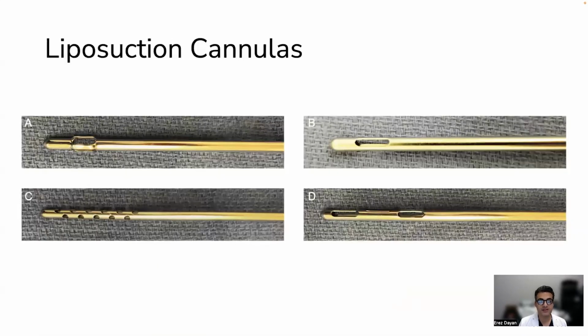Now, liposuction cannulas, there's a plethora of different liposuction cannulas. You're going to have a list in your packet that demonstrates what materials you should have to start. Normally, we recommend purchasing a 3mm, 4mm, and 5mm cannula. It's good to have what we call a basket cannula because we like to use the basket to equilibrate the soft tissue. There's a concept in liposuction called safe liposuction. What that means is you inject the local anesthesia, just like I showed you, and then we use a basket cannula off suction to spread and dislodge the fat, ensuring that the local anesthetic is well distributed.